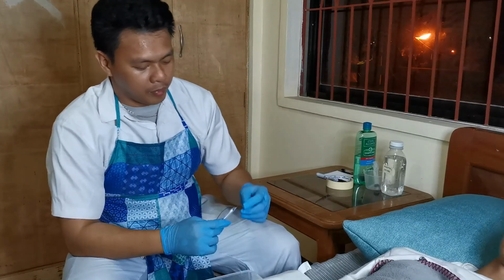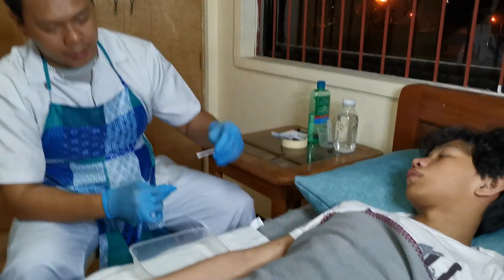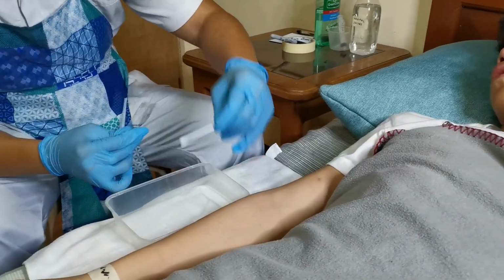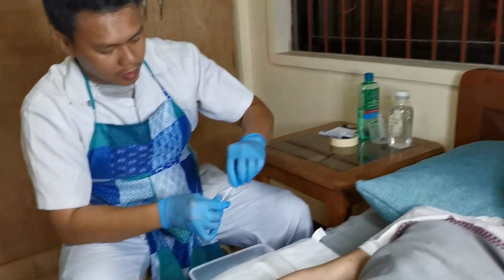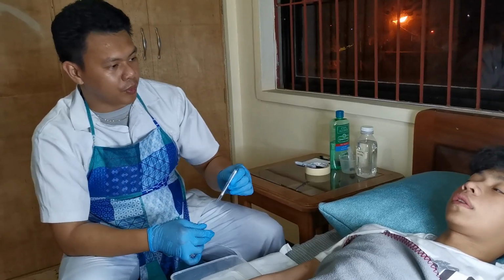Number 9. Obtains culture after cleansing with non-bacteriostatic saline when indicated. This provides sample for the lab for further analysis. Sir, magkuha ta og gamay nga sample sa imong samad ha. Ato ni siyang ipadala sa laboratory para mahibal-an kung kumusta na imuhang samad, kung naa bay infection or paayo na ba siya.